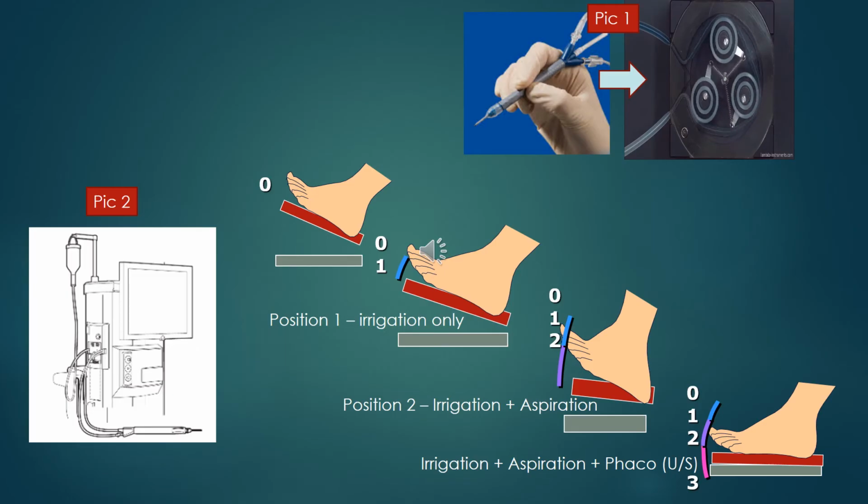However, note, during this time there will be no flow, because if you press a plastic bottle full of water in your hand, as long as you have not removed the cork or the cap, you have a pressure on the bottle, but you will not have any fluid coming out of it because the cap is there.